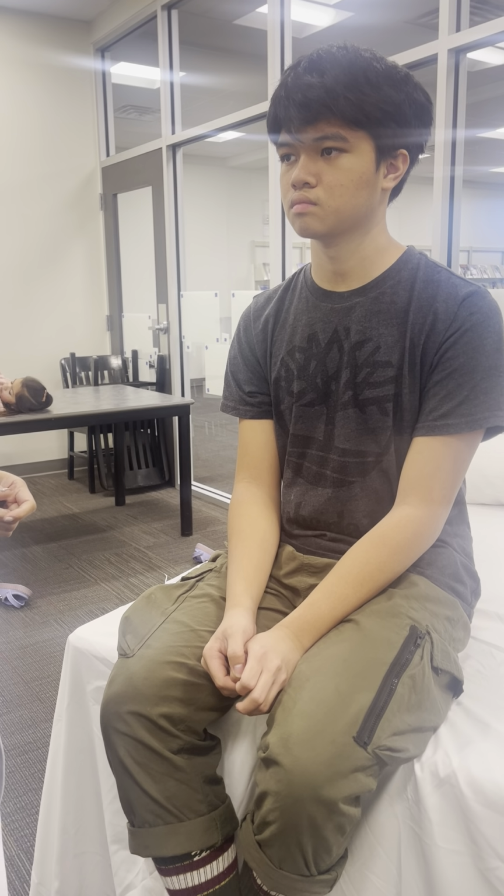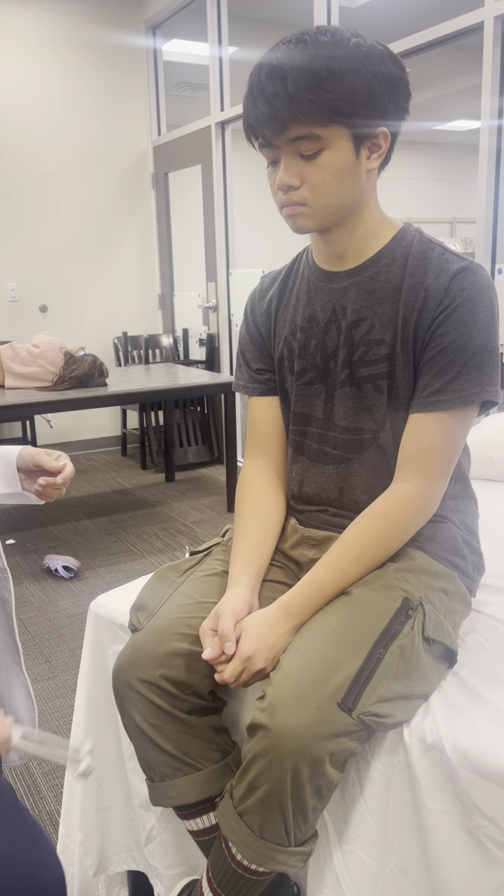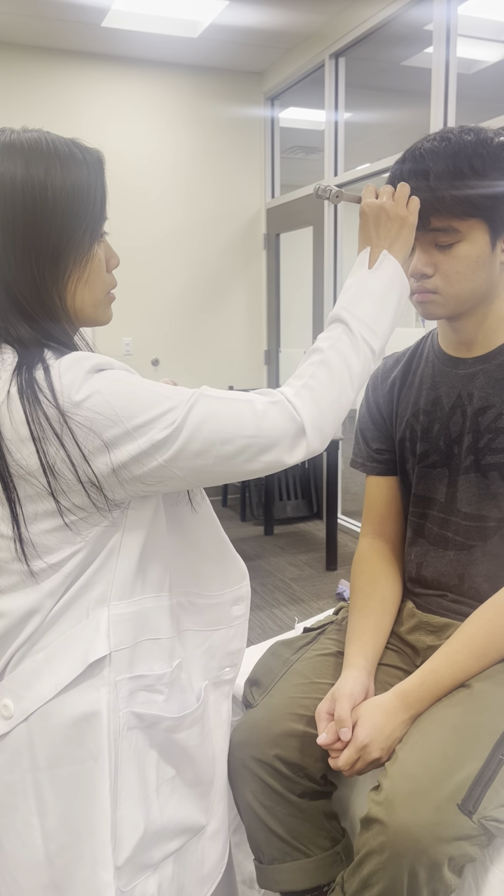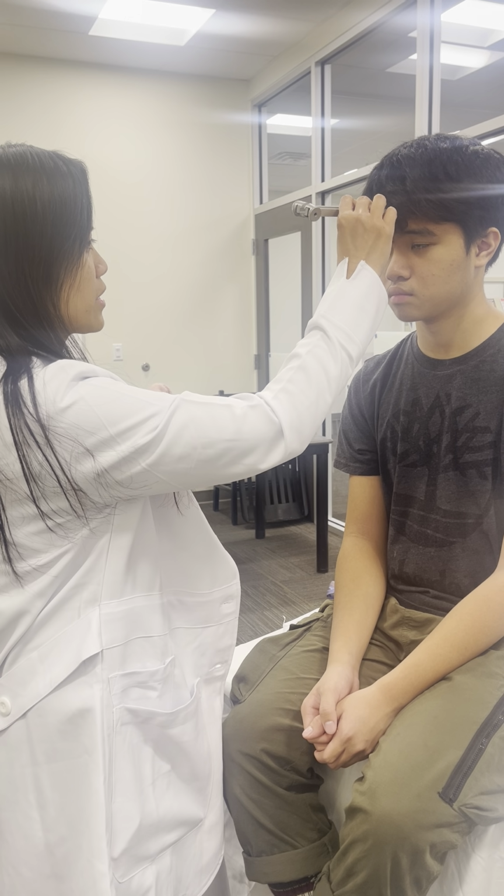So for the Weber test, I will assess for the conduction into the ear. So I will strike my tuning fork and place it on the forehead, on the top of your head, and then you will tell me if you hear or you feel it, okay? Do you hear anything or feel it?